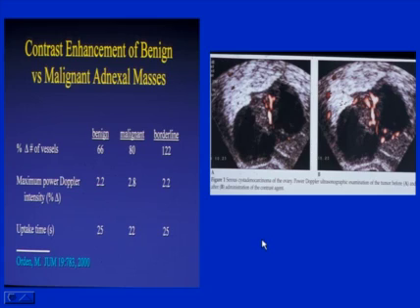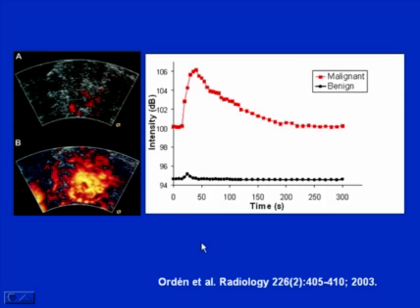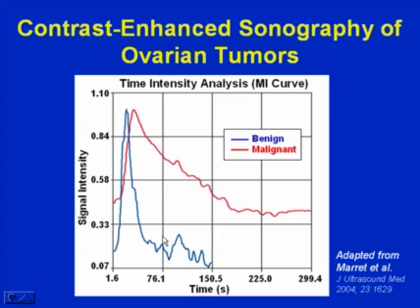The first study was from Finland, where they used Doppler, and Doppler has the problem of decreased temporal resolution and blooming, but they did find a difference in uptake time in tumors versus non-tumors, and this is a follow-up of their study showing that tumors had overall increased intensity and longer dwell time.